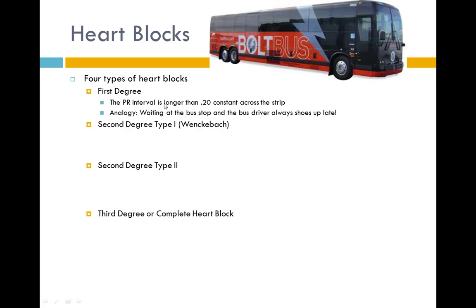So my analogy is if you're waiting for a bus at the bus stop, this is like the bus driver every day picks you up at the same time, but he picks you up late every time. All right, so that's first degree heart block.